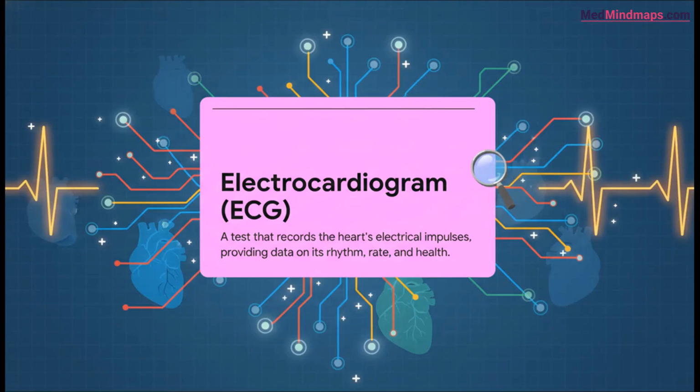All right, so what is an ECG, really? At its core, it's a totally non-invasive test that just records the heart's electrical activity. Just keep thinking of it as that dynamic map we mentioned. It shows us exactly how electricity is flowing through the heart with every single beat. You can see why this map is our best window into the heart's overall health.